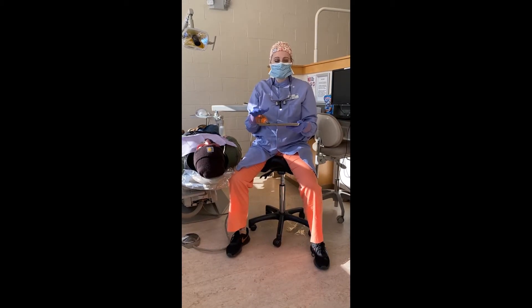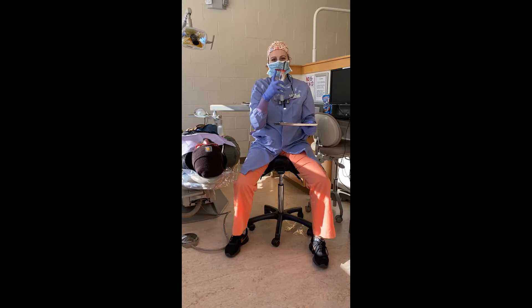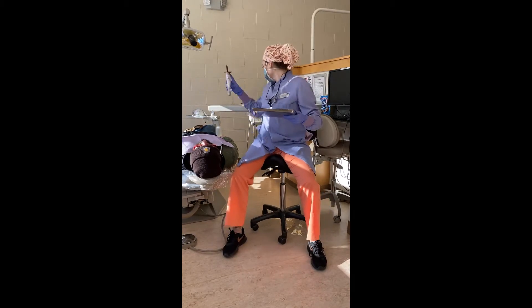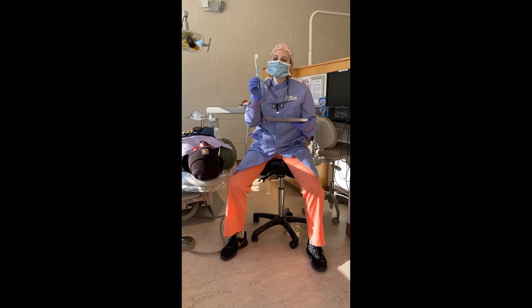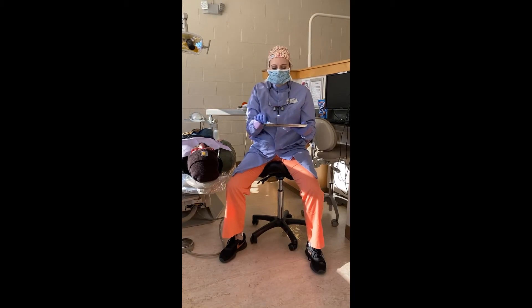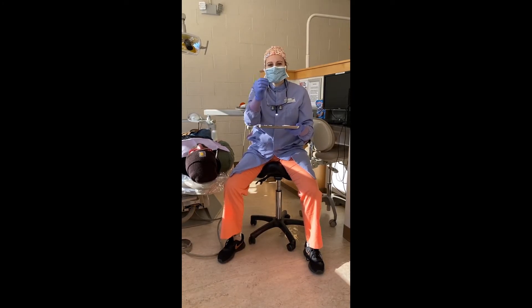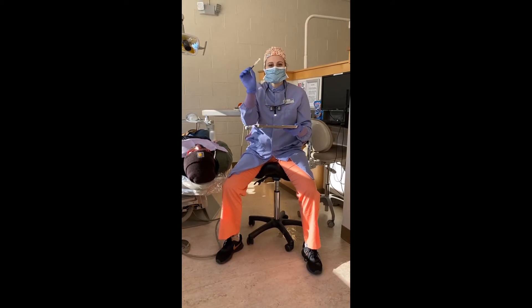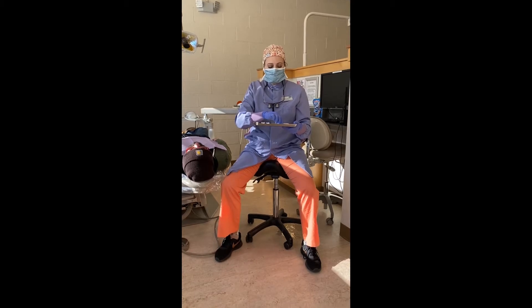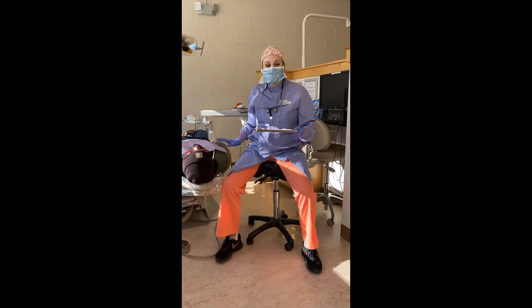You are going to need a few things to get started. You're going to need a curing light that has a barrier on it, in addition to an orange shielding protector. You will also need a toothbrush — this is going to help clean the occlusal surface of the patient's teeth to get rid of any debris. You will need a dental mirror, a shepherd's hook explorer, your sealant material, your phosphoric etch material, and then some sort of isolation. I'm going to use a combination of cotton rolls and a triangle to obtain a fairly dry surface for my patient.